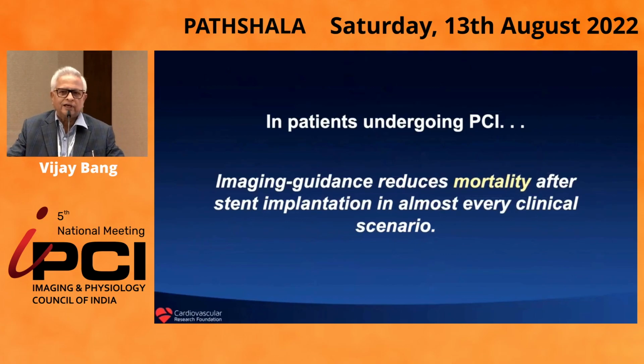Currently, we have almost 250 OCT machines in India and almost 500 IVUS machines. And we do about 1,500 procedures monthly which are IVUS or OCT guided PCI. And this number is slowly but definitely growing in India.